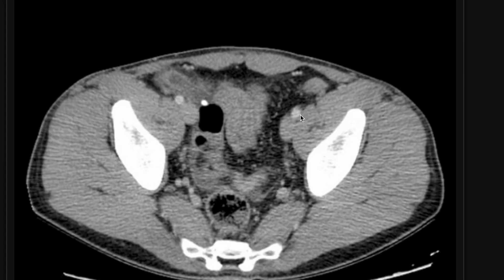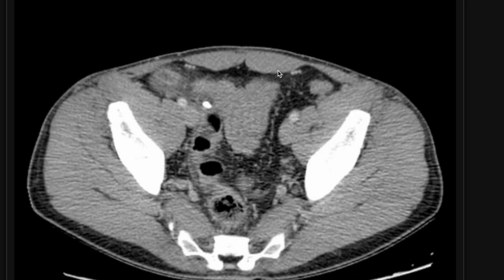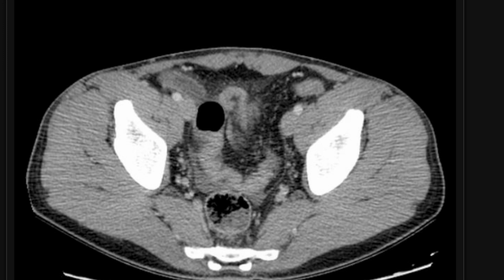In this case, the appendix is inflamed. I'm going to point out the appendix to you — it's not always easy to find, but in this case, this is the appendix here. It's this tubular structure. Watch as I scroll back and forth. This is the appendix, and I'm going to stop on this image now and point out some things. This is the appendiceal wall that is hyper-enhancing — this slightly bright line right above where I'm outlining. It's a little bit hyper-enhancing, so that's clue number one.